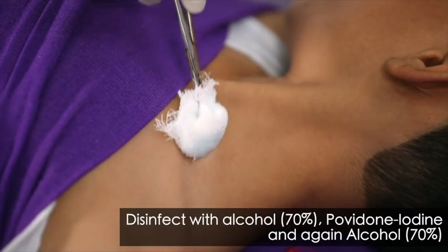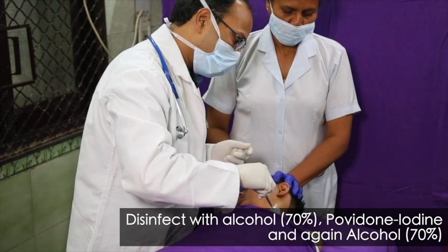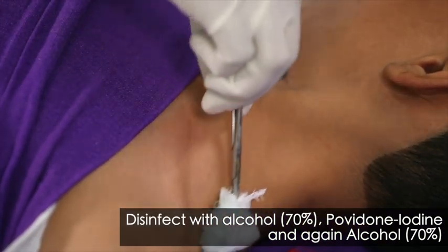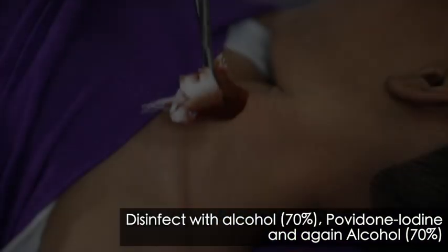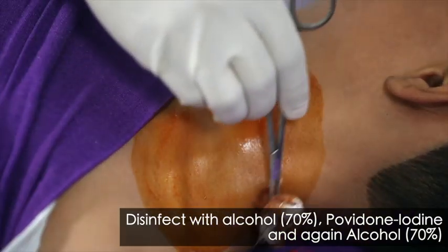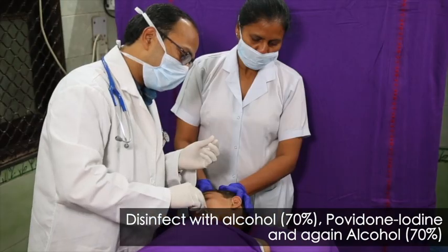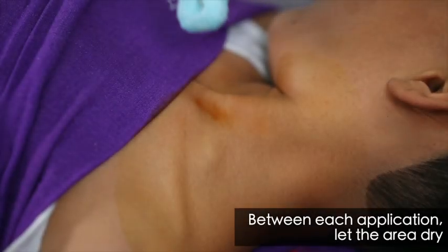Disinfect the skin at the planned needle puncture site, firstly with alcohol 70%, followed by povidone iodine, and again with alcohol 70%. Between each application, let the area dry.